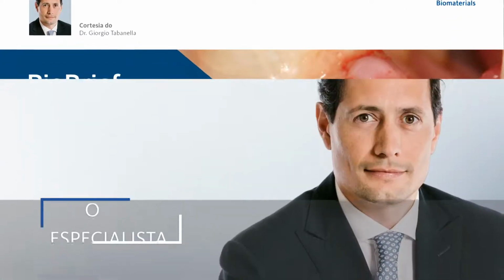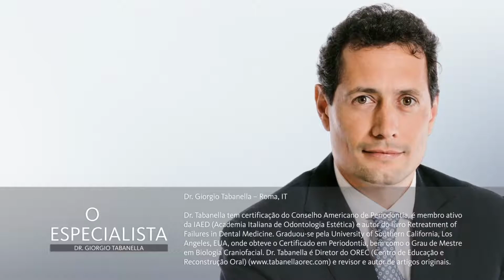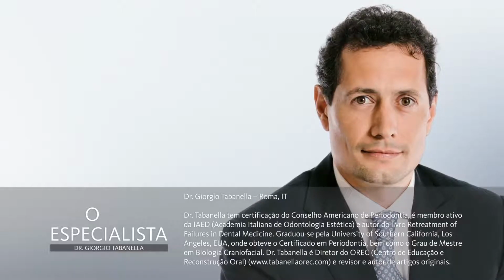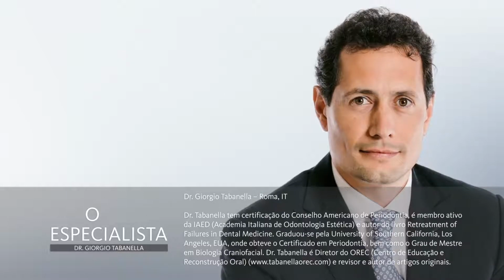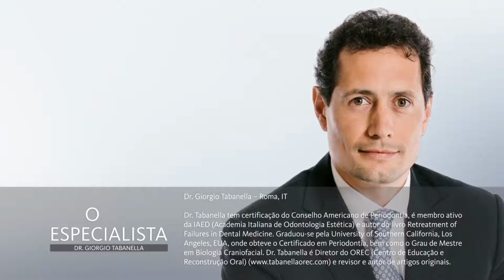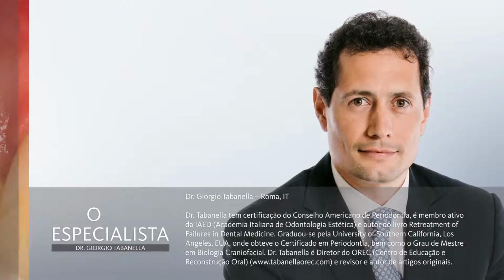Dear colleagues, I'm glad to introduce the use of the buccal pedicle flap for peri-implant soft tissue boosting. I'm Giorgio Tabanella, American board certified in both periodontics and implant dentistry, and my field of expertise is the treatment of failures in dental medicine.